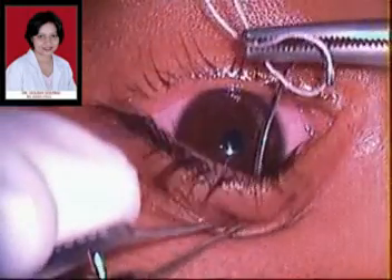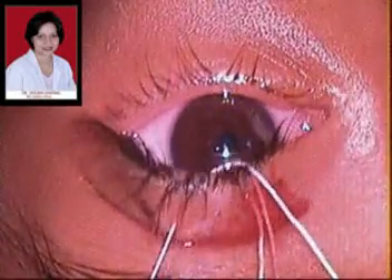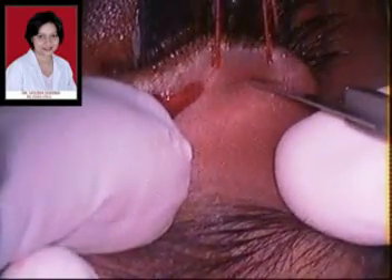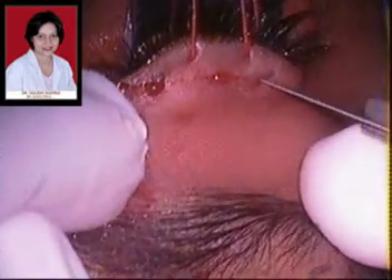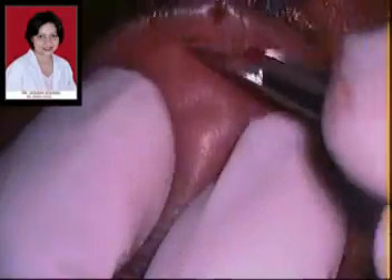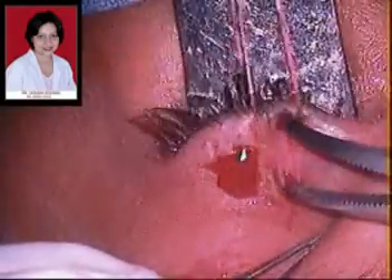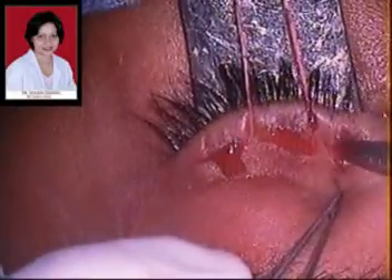Once all the incisions have been marked we then pass stay sutures through the eyelid margin and use a lid spatula coated with ointment to guard the eyeball. The marked incisions are then made and deepened in the eyelid to the level of the tarsal plate. As you can see here, this is the white shiny tarsal plate visible through the incisions.